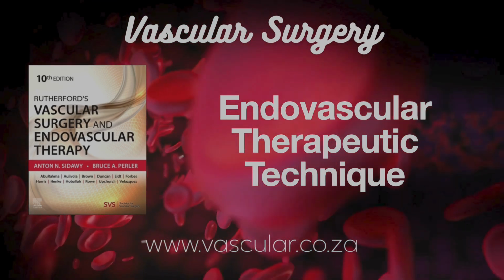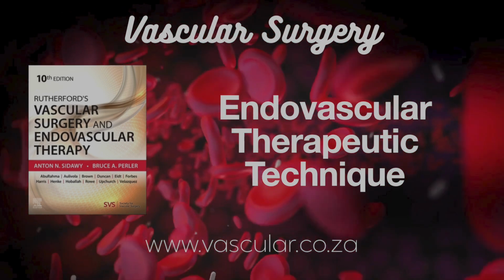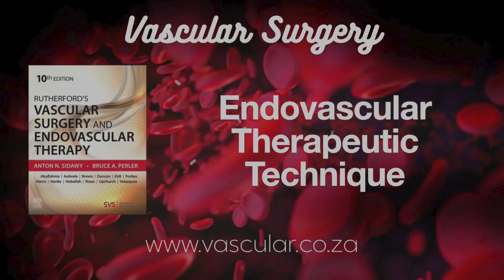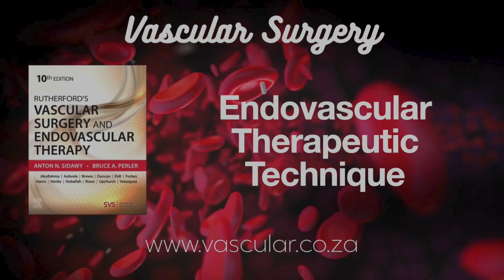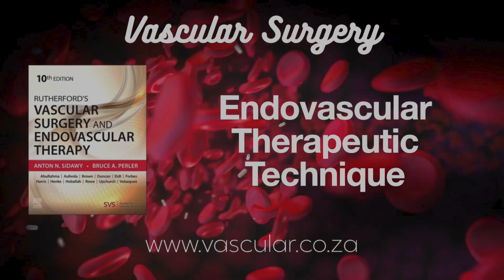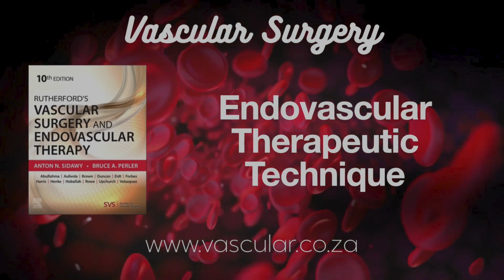It's been studied for peripheral arterial clots, with high technical success, though 6-month patency was around 65% in one study, and amputation about 12%. Other devices, hybrid approaches. Yeah, the Trellis catheter combines lytics with mechanical disruption and aspiration, using balloons to isolate the clot segment. It shows good results in acute limb ischemia.